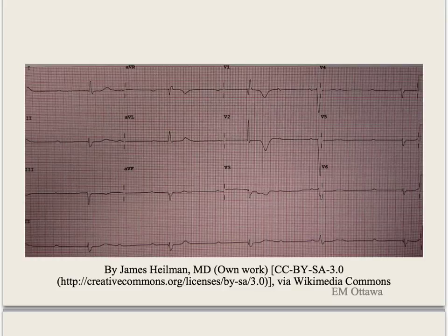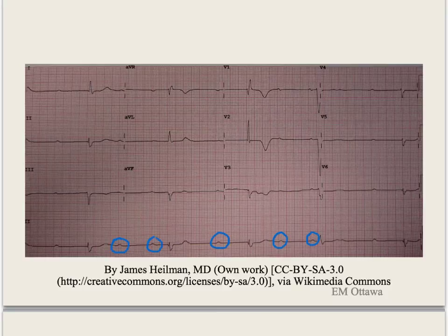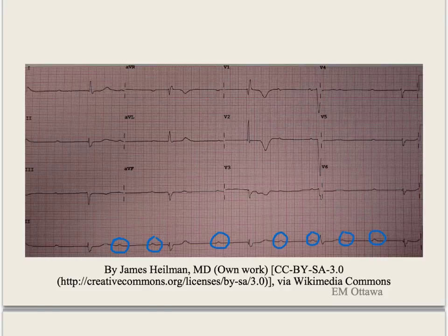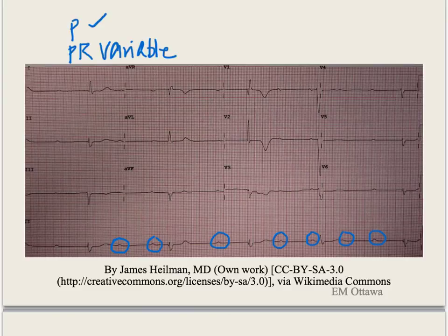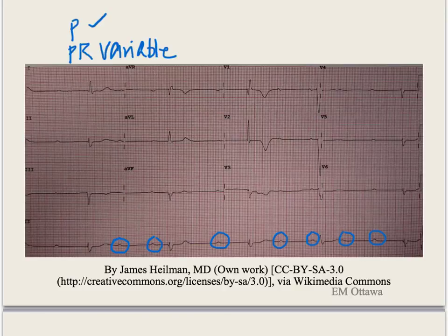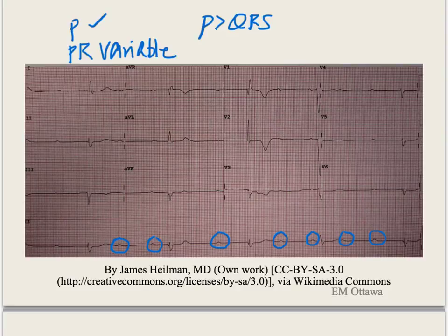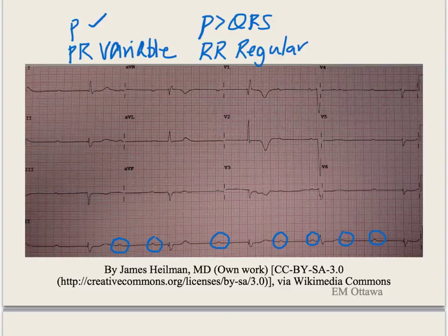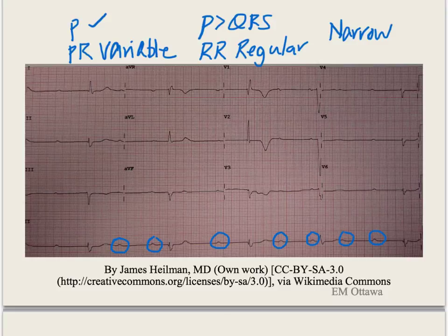Looking at this 12-lead ECG example: P waves can be picked up fairly easily in lead 2. The PR interval is all over the map. There are way more P waves than QRS complexes. The RR interval is regular, and the QRS complexes are narrow. Based on these criteria, this is another example of complete heart block.